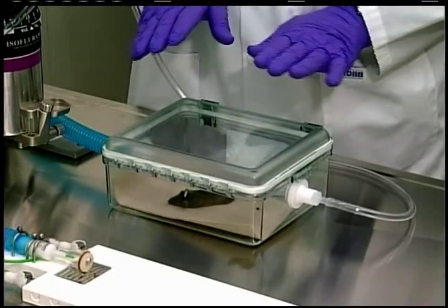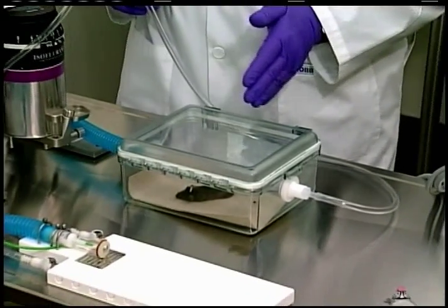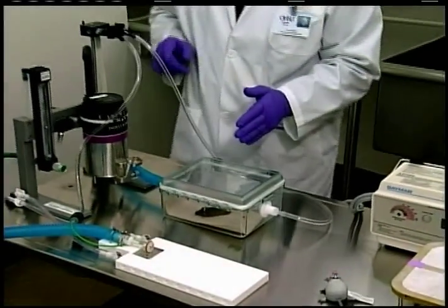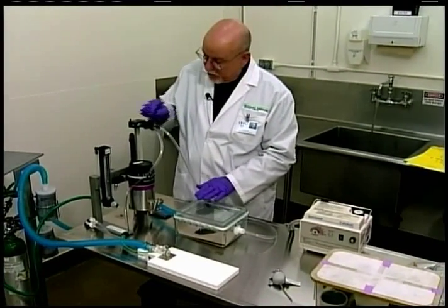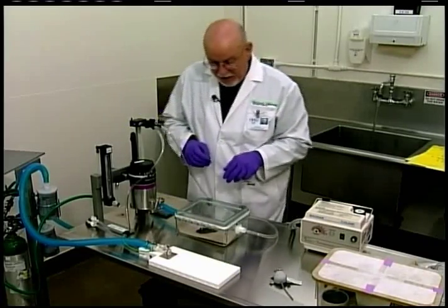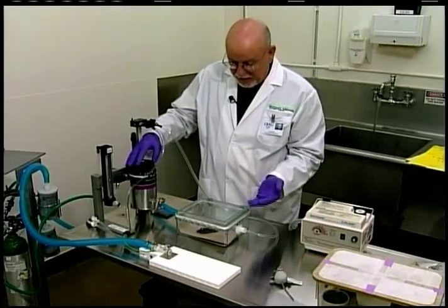Once the animal is equilibrated in here, and we like to allow him about another 30 seconds to a minute to become equilibrated with the inhalant anesthetic, we'll close off the flow of the inhalant anesthetic from the induction chamber and open up the flow to the non-rebreathing system. And now I'm going to open up the induction chamber and take the animal out.